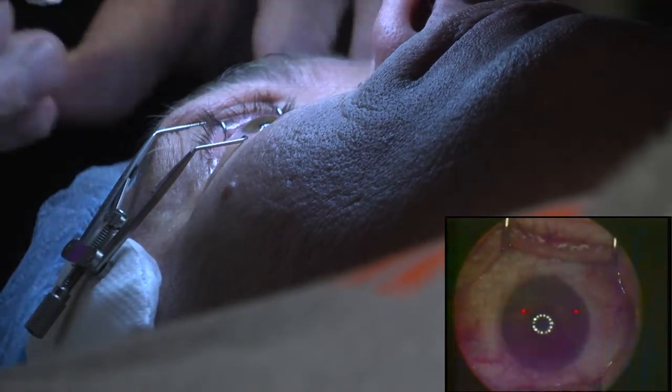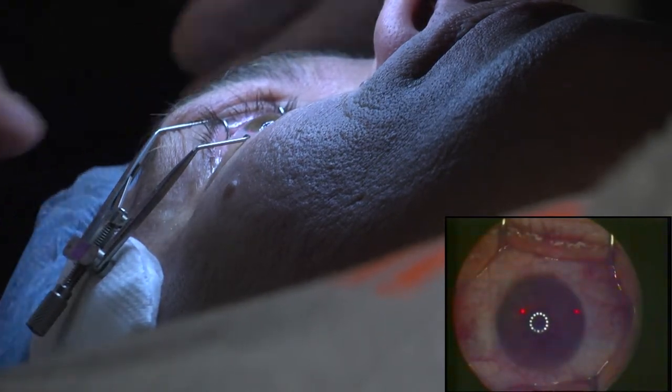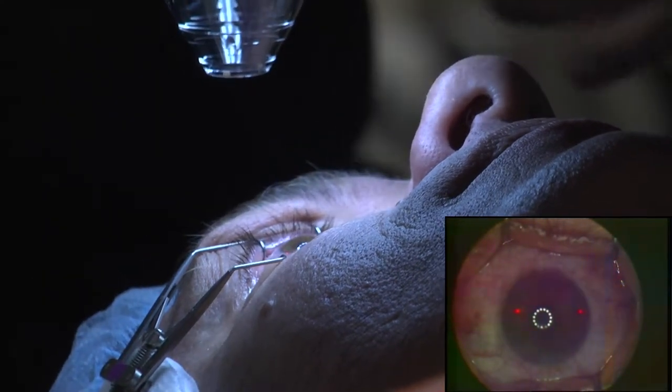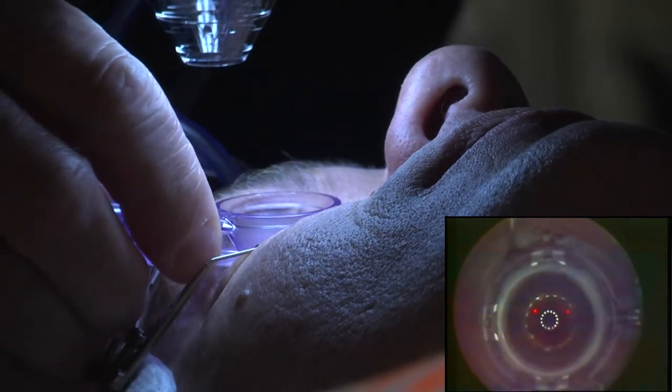Now I'm going to go ahead and put on another little drop. You just keep relaxing. And now you're going to feel some pressure. This is where I don't want your head to drift up or down. You'll just feel some pressure. It's almost like a big eye hug.